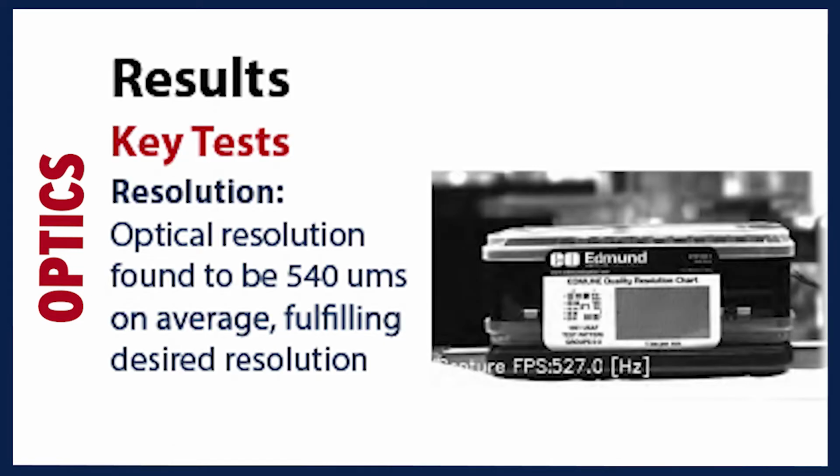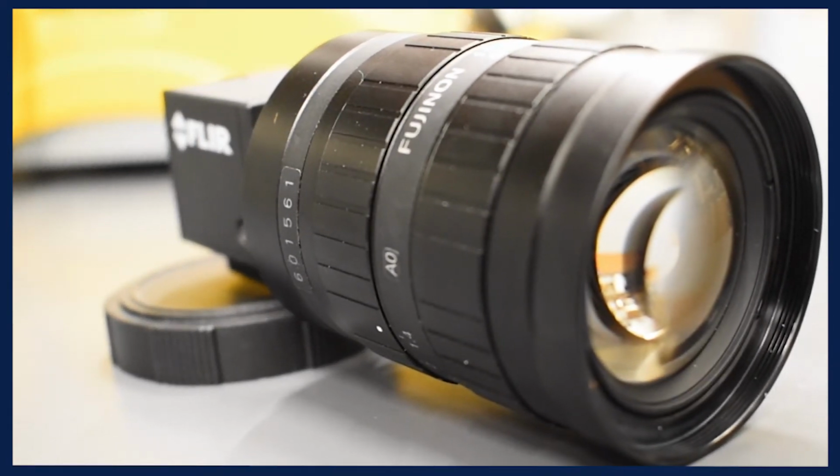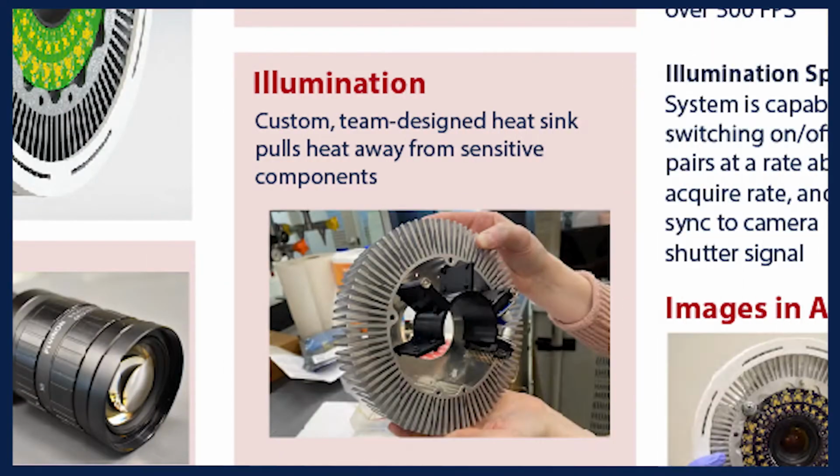Together, they are able to effectively image an object half a meter away with a resolution of 540 microns, successfully fulfilling the system's resolution requirement. For the next subsystem, I'll pass it off to Shannon.